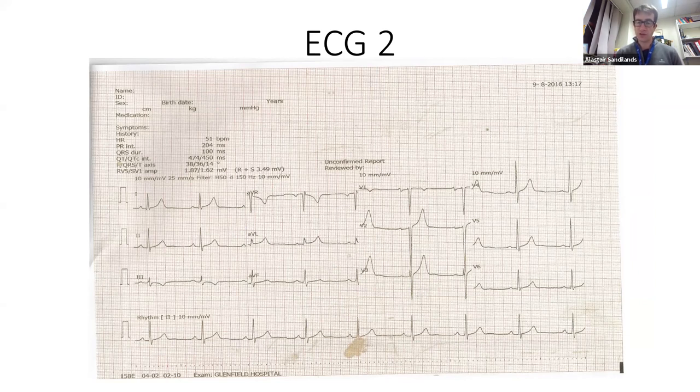Again, for the QT interval, the easiest way is to pick a lead at the beginning of the line and then go across. Yeah, there's two large squares there. That's probably okay. Are there any T wave changes? Yep, a little bit of inversion in V1, which is normal. It's always negative in aVR, so that's normal. And there's T-wave inversion in lead III, which is normal on its own. Okay, so that's another example of a normal ECG.